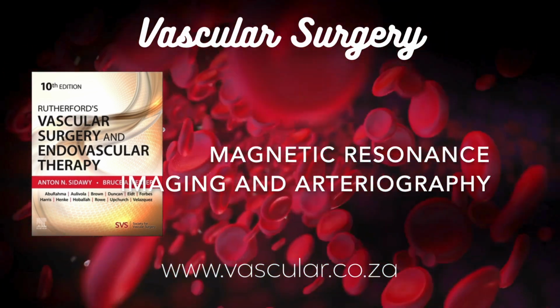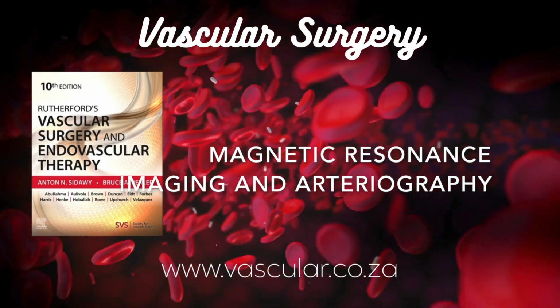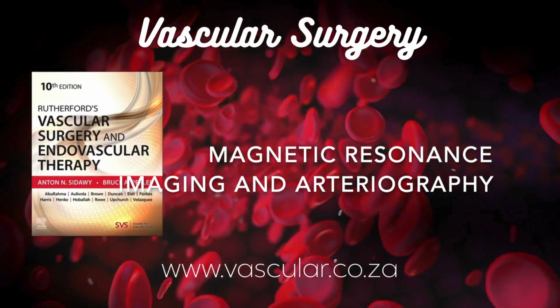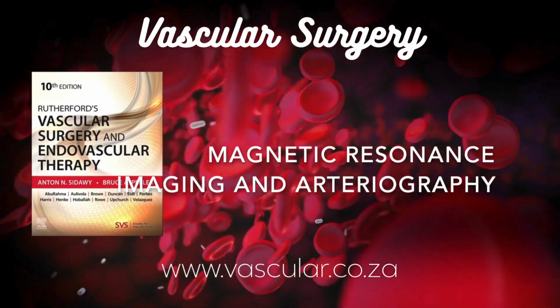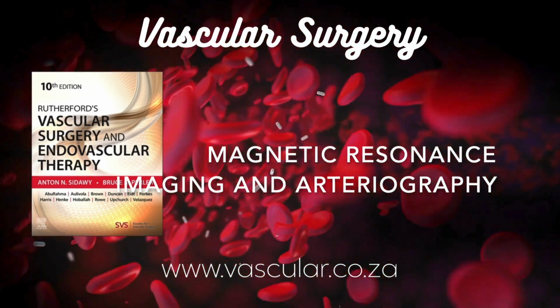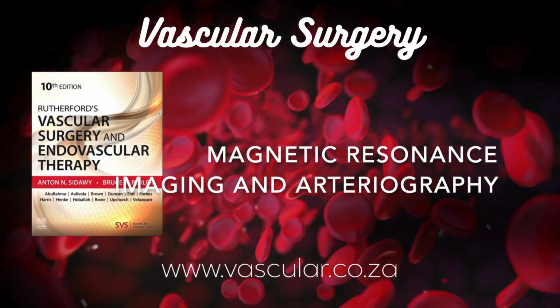It's a big undertaking. So, honestly, for routine vascular imaging in a patient with a non-conditional device, CTA is almost always preferred if possible because it avoids all these MRI-related issues. But the rise of MR conditional devices is definitely making MRA more accessible. Good to know. What about things like vascular stents, IVC filters, or coils used to block vessels?